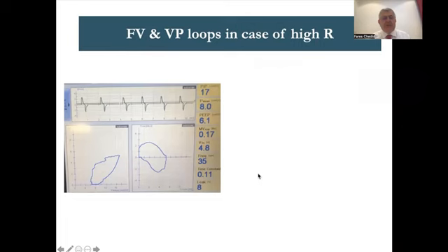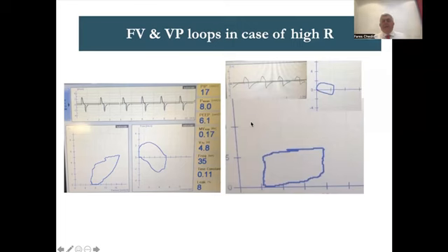Here is a patient with normal compliance. You see the VP loop is in here. The pressure is on the x-axis, and the volume is on the y-axis. A little bit of pressure has pushed the volume quite high very quickly. It's not rectangular. Slightly slower during expiration, but quite quick. So here it's a good patient without high resistance, and the flow goes from zero and returns to zero because we have enough inspiratory time.